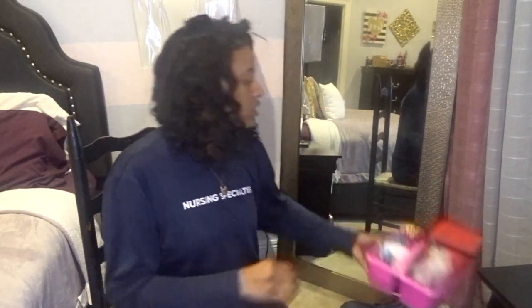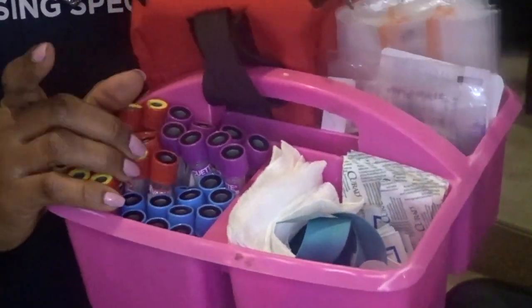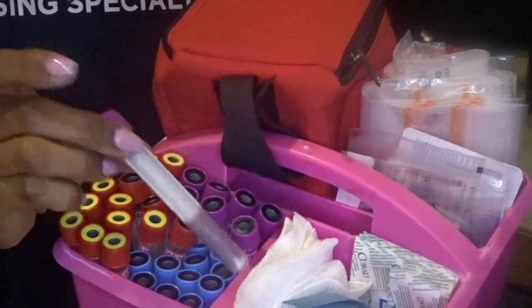Here is my phlebotomy kit. These are the tubes that we use — these are your chemistry tubes, and then these are for PT/INR, and then of course purple lavender top tubes.